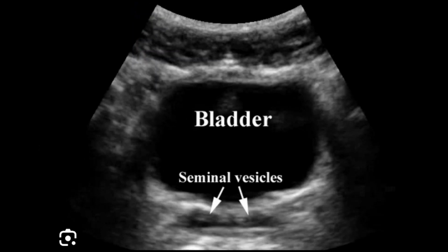For the urinary bladder scan, it is important that the bladder should be sufficiently filled. How much filled? It depends from individual to individual, upon the patient's capacity, and also upon the patient holding the bladder. But you need a full bladder if you want to assess intraluminally, because sometimes small polyps, polypoidal lesions, or transitional cell carcinoma may be sitting in the base or on the lateral walls or on the superior wall. You have to be very careful when scanning the bladder.